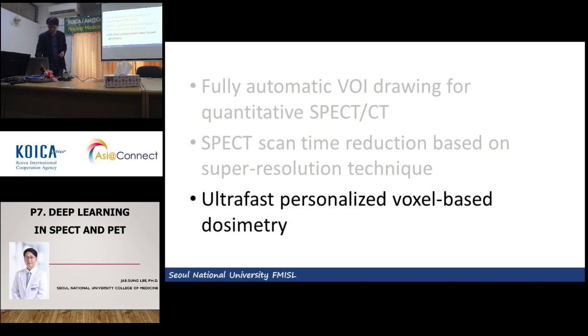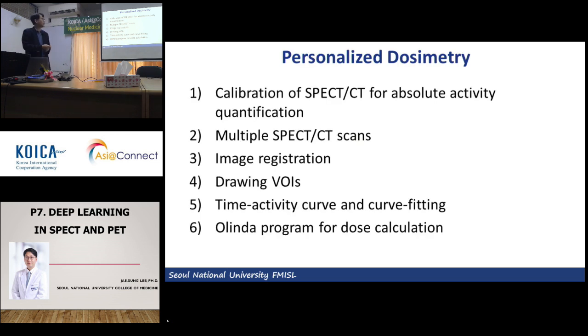So let me explain it. Why do we need the Monte Carlo simulation for voxel-based dosimetry? Look at this. I have summarized the procedures for personalized dosimetry.